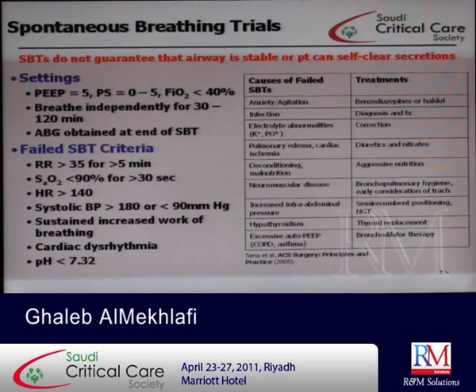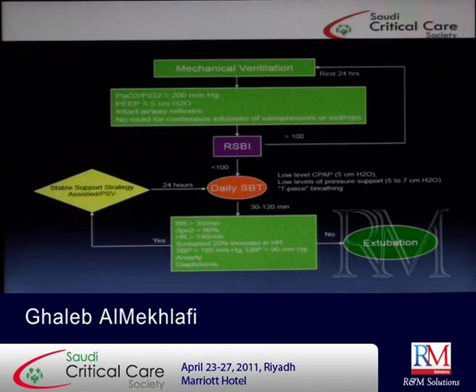Okay. Now what is the spontaneous breathing trial? For the spontaneous breathing trial, you put the patient on settings, the patient is ready to wean, you check all the parameters, and you put the patient on a spontaneous breathing trial with a PEEP of 5.